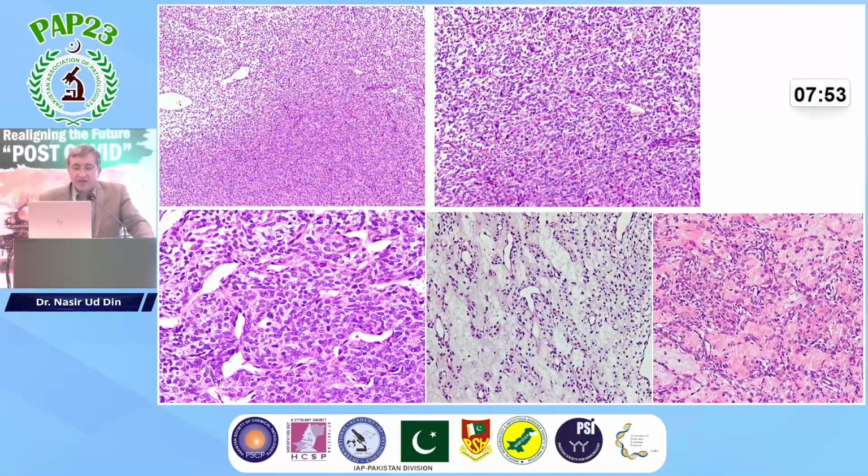Histologically, these tumors are composed of mostly alternating hyper- and hypocellular areas, and the cells are monomorphic round to ovoid with a prominent vasculature which ranges from dilated hemangiopericytoma-like vasculature to chicken wire vasculature. This pattern morphologically looks like a clear cell sarcoma of kidney, and is a very useful feature to suspect these BCOR-rearranged sarcomas on H&E. And these sarcomas also show a variable myxoid and collagenized background.